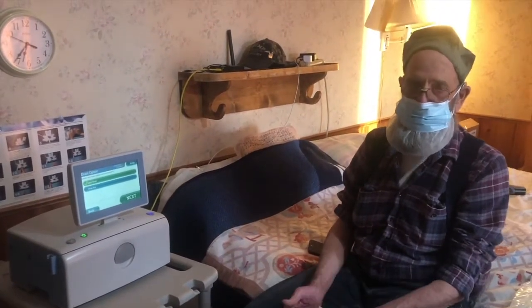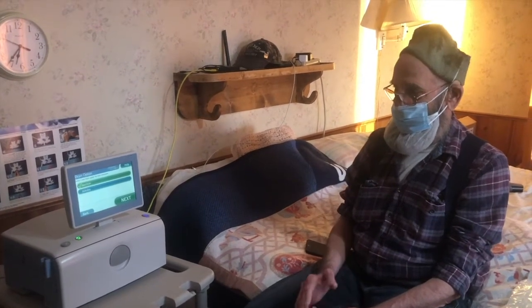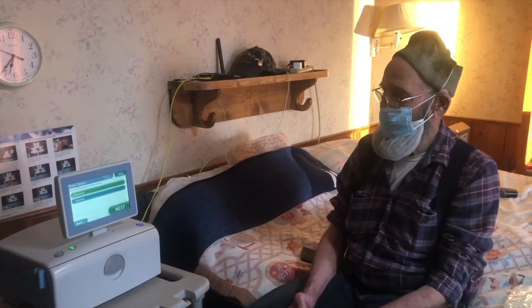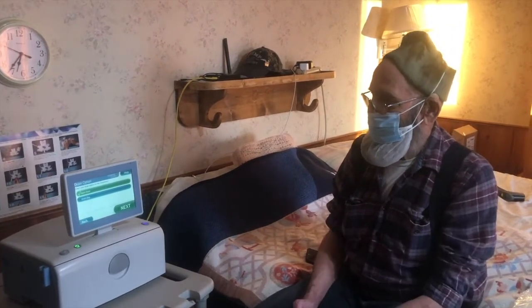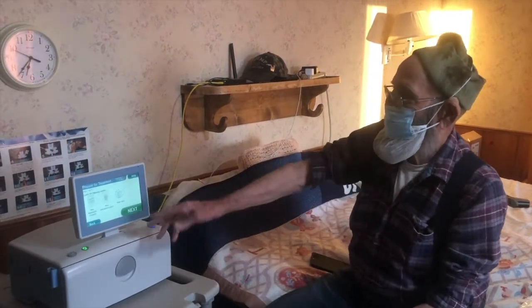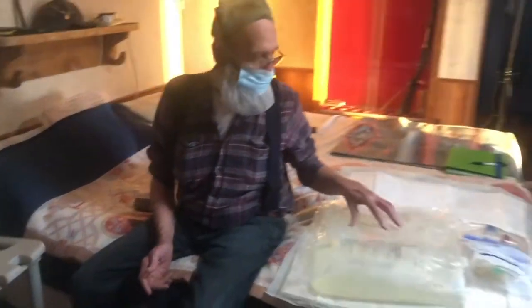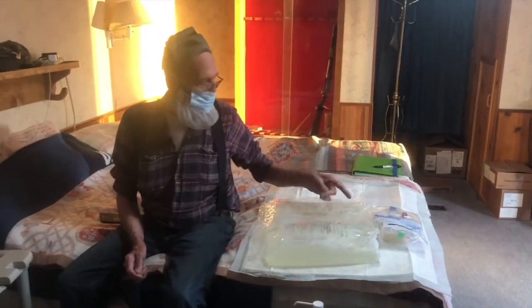So we're not saving the fluid. We do that once every 90 days. We have to save the fluid and save the urine, so they can analyze it and keep track of your health. But tonight we're just putting it down the drain. So we got an open drain. Gather your treatment supplies according to your program. We got our liquid here, our fluid, our solution, and cassette.